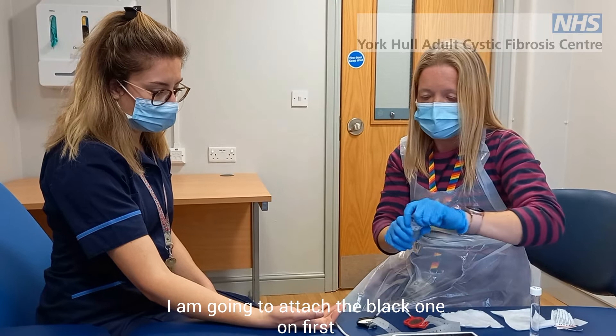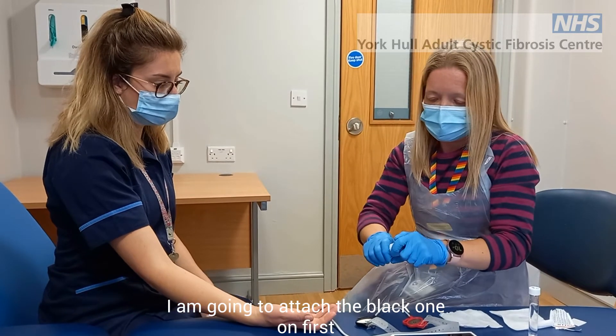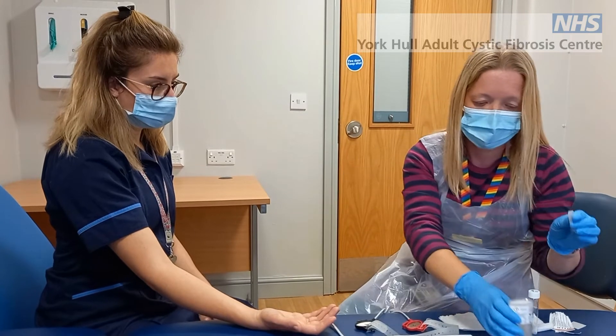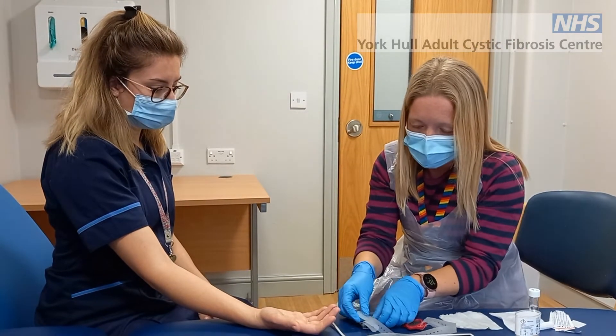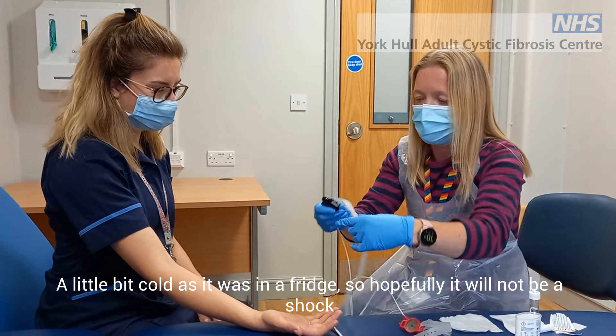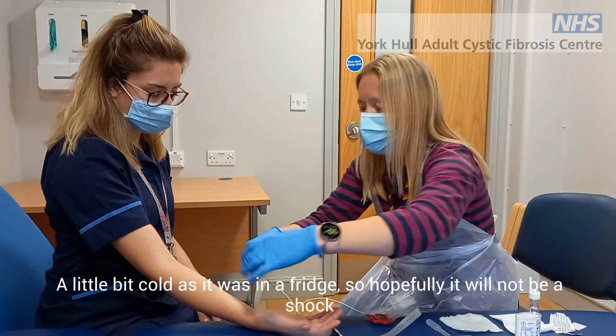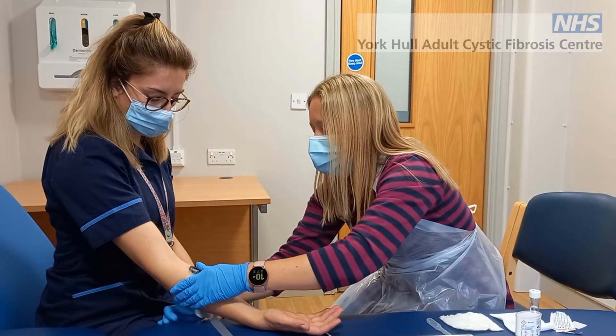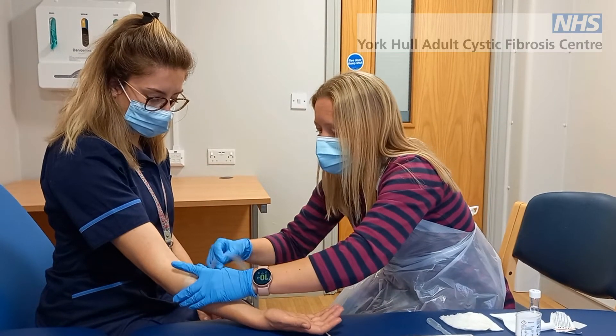We're going to put the black one on first and get all of the jelly discs out. They're a little bit cold as they've just been in the fridge, but it's not too much of a shock. We'll put that one there and strap it in place.